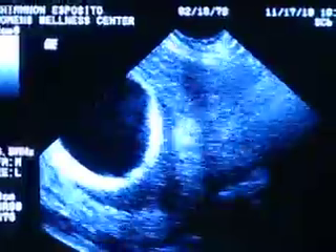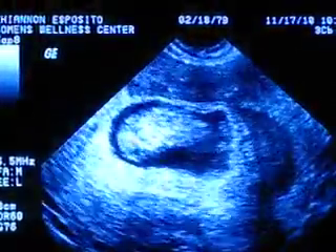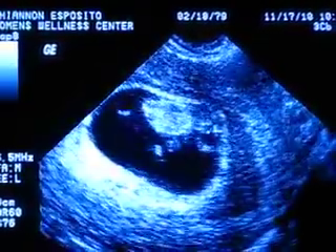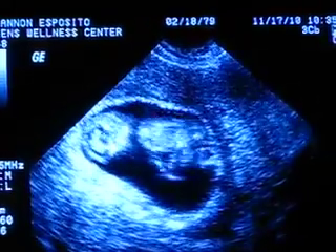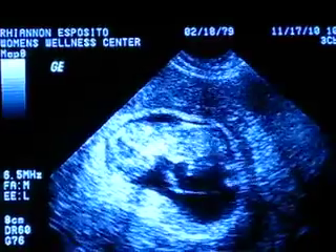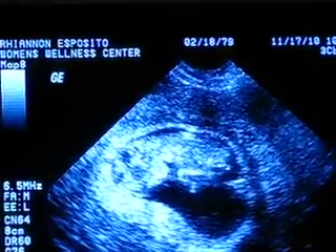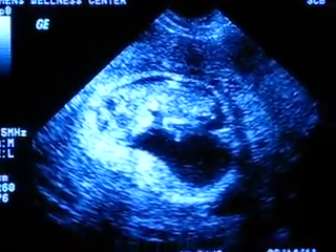Hi, you were just down in the corner — look at you wiggling and moving all over the place, showing off for your mama. Arms and legs and head and face, kicking and moving. Let's get some pictures of arms and legs. Can you see? Oh yeah, yeah.